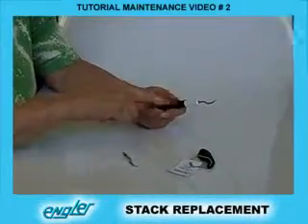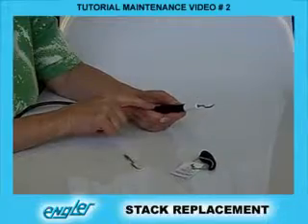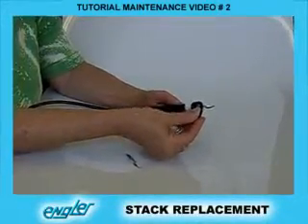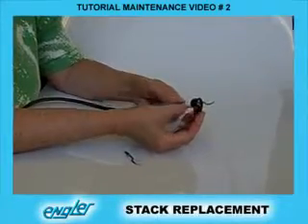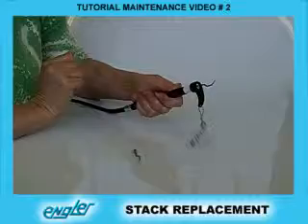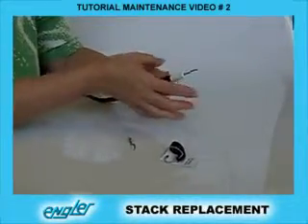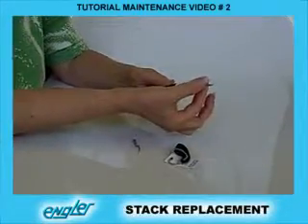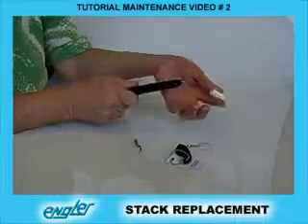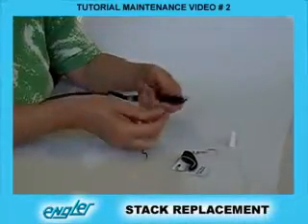If you need to replace the insert or stack inside the handpiece, take your tip wrench, put it over the tip onto the white nose cone and quickly turn counterclockwise. Remove it and then unscrew the tip until it comes out. Remove the nose cone — it does not unscrew, it just pops off — and take out the stack.